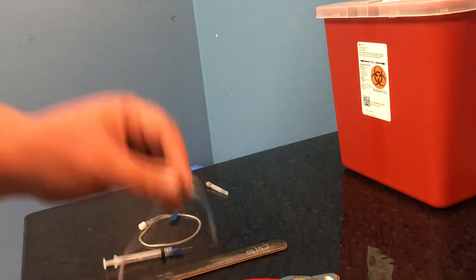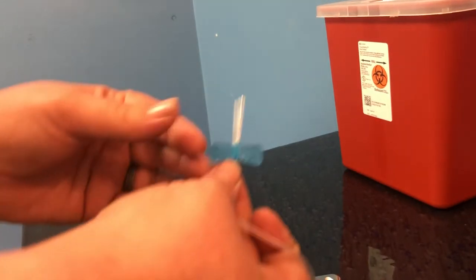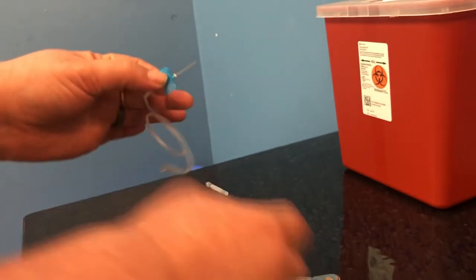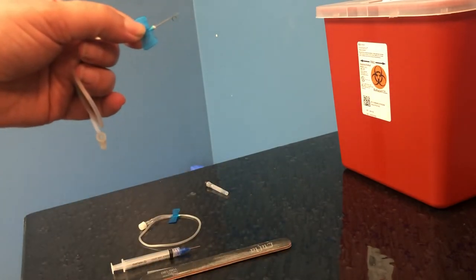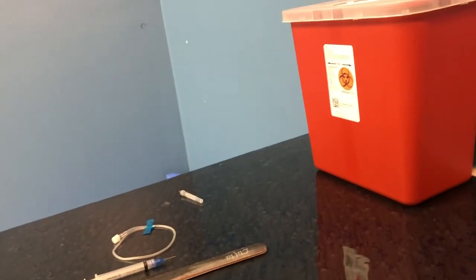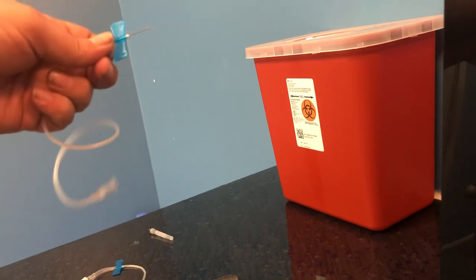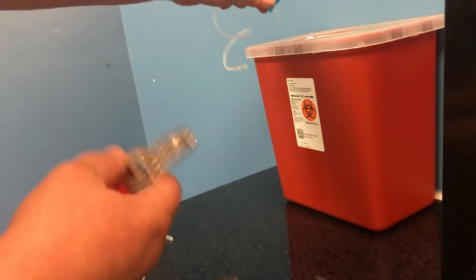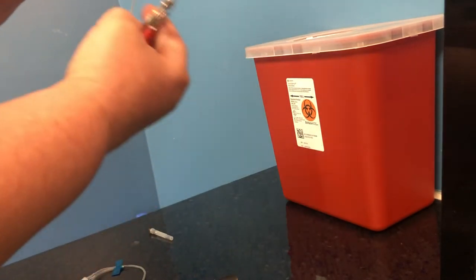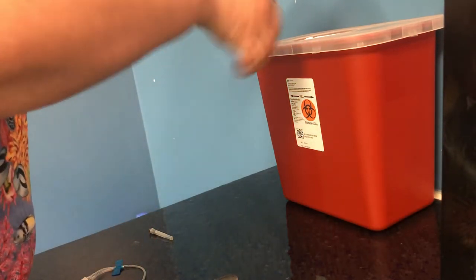If I'm gonna make a butterfly for the purposes of training, I do this for clients all the time. I'm gonna take a regular butterfly, I'm gonna take the cap off, I'm gonna take a regular pair of nail clippers. I'm gonna turn the camera just a little bit so you can see my sharps container. There we go. So I'm gonna insert the tip of the butterfly into the sharps container through my nail clippers. So it's gonna be like this, but I'm gonna do that inside the sharps container.